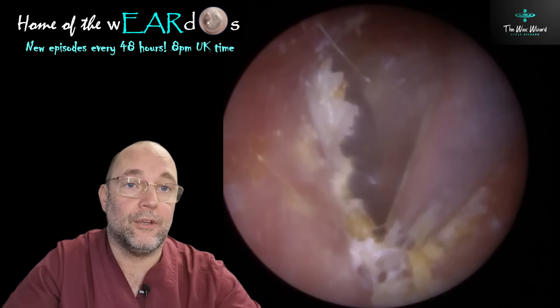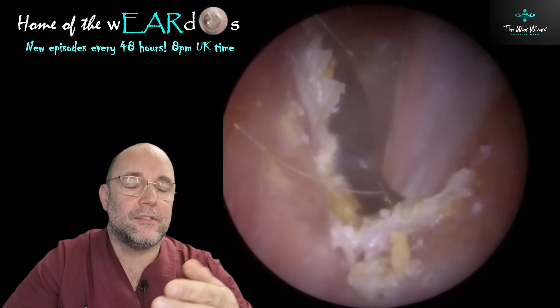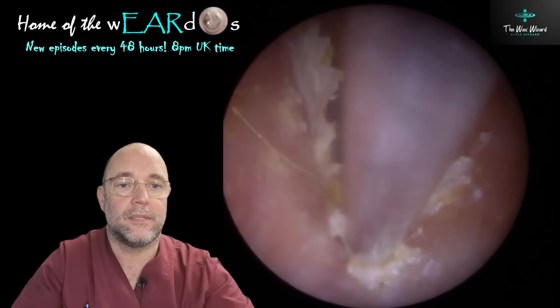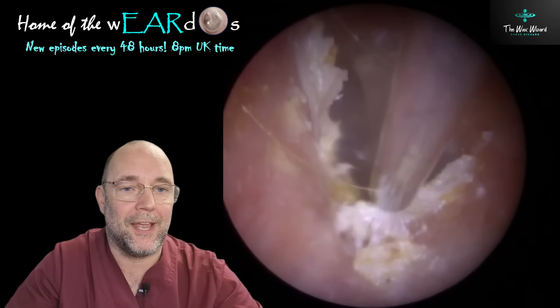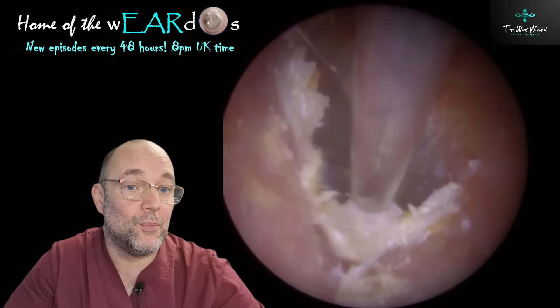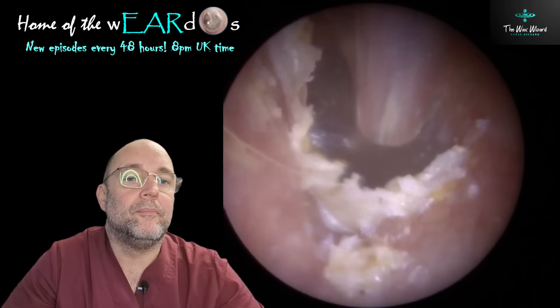He could already hear better at this point, so technically the problem was solved — but why we're going further is that the shed skin from behind, even from the top layer of the eardrum, would try to work its way out and just get stuck behind that remaining piece and build up, meaning he'd be back in the not too distant future. If I was completely unscrupulous I would have left it there, knowing full well he'd need to come back, but I'm honest to a fault — I think we can buy him a bit more time if I try to get rid of as much of this as I possibly can.